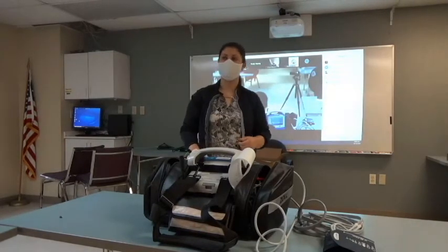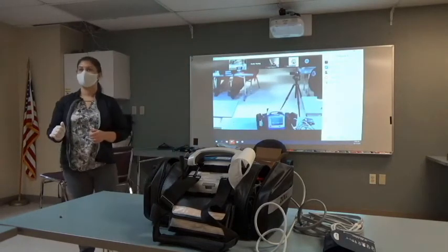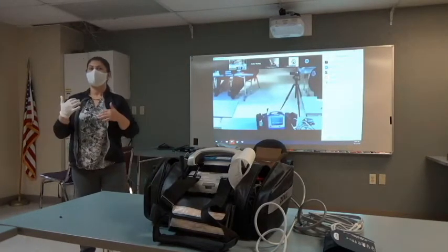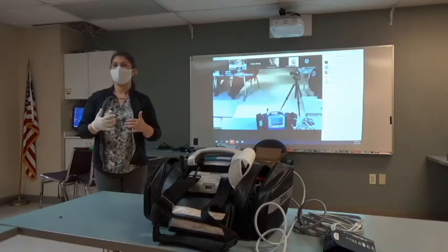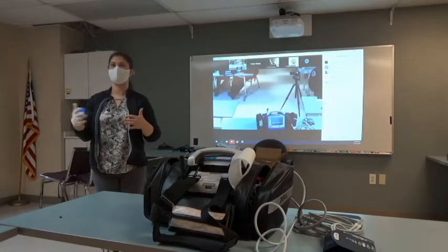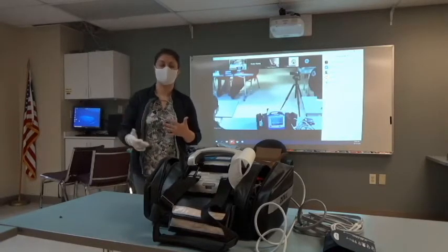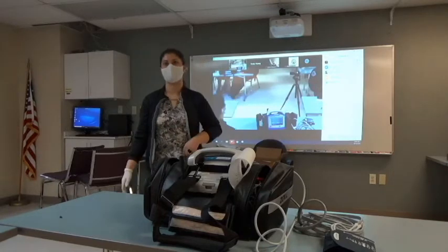Okay. Any questions? If you have to replace a line because it's occluded, do you have to start it all over again manually? I personally would. That's just the habit I get into. But if your protocol or your department's different about doing that, that's just the way I would do it, is I would shut it off and run through that process again.